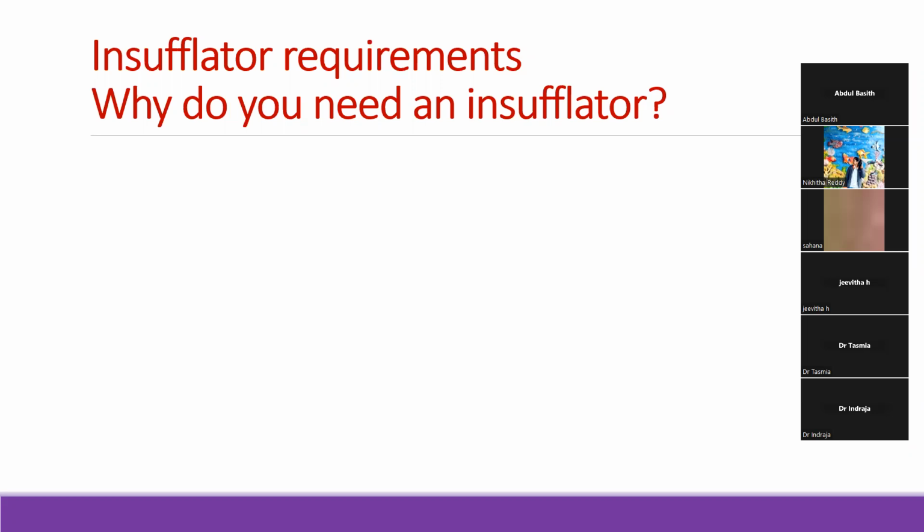Flow rate. Filter. It should have filters. Very good. Even though you get medical grade carbon dioxide, you don't want particulate matter entering the abdomen, so it must have a filter. Yes. What else? Flow rate, sir. Flow rate, yeah, that depends on the degree of leak, and so you would want the machine to keep an eye on the flow rate, which it does through the pressure monitors.